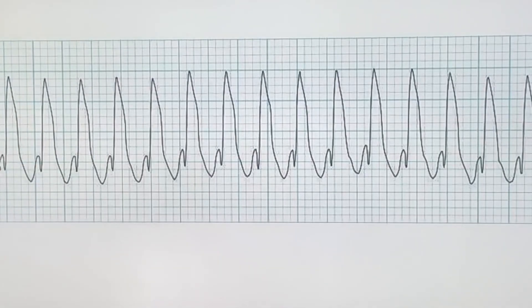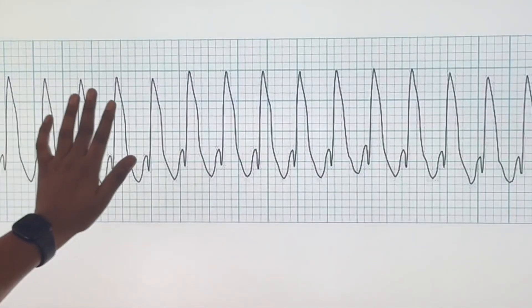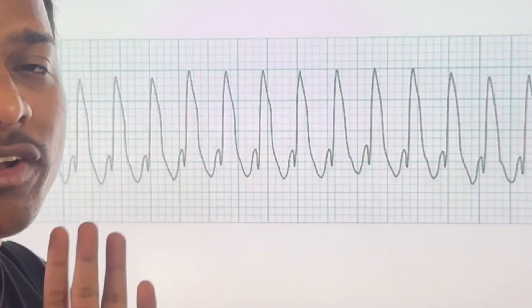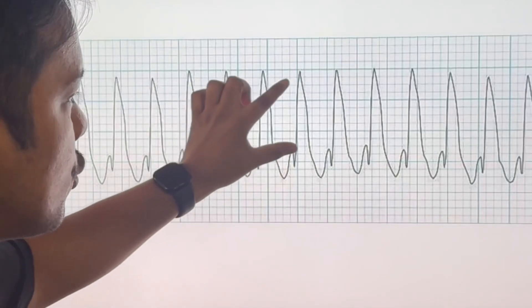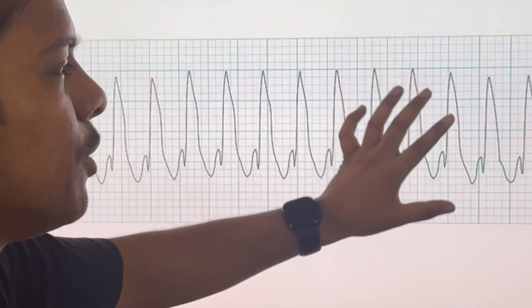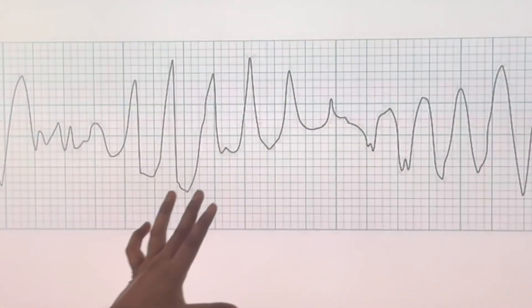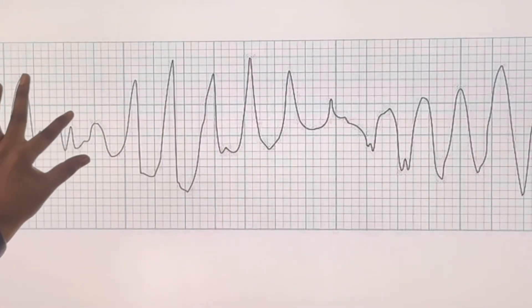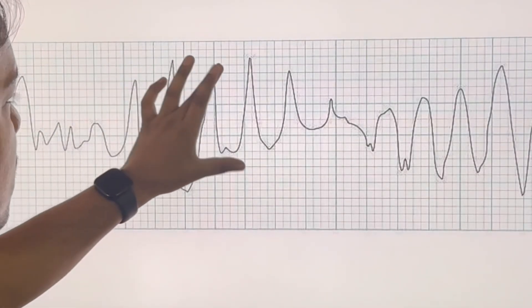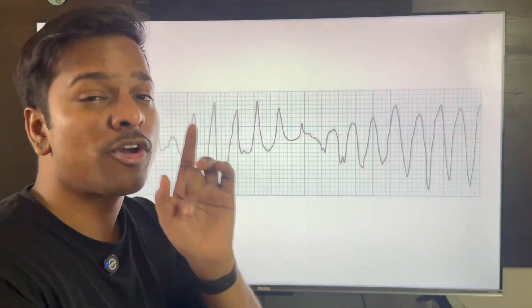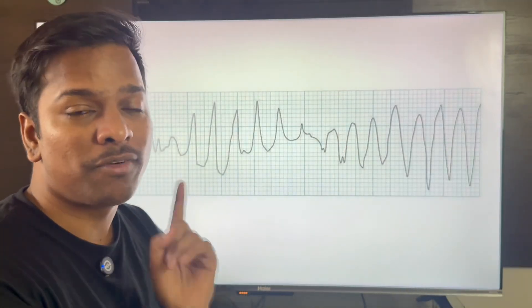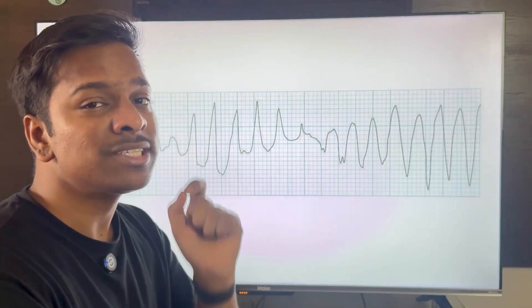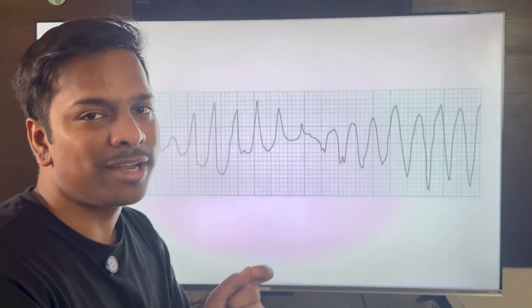In this ECG, there is a single focus — this is called monomorphic ventricular tachycardia because the morphology of the QRS complex is the same throughout. In this next ECG, the morphology of the QRS is different for each complex, so this has to be polymorphic ventricular tachycardia.